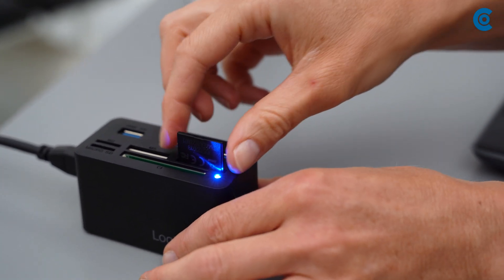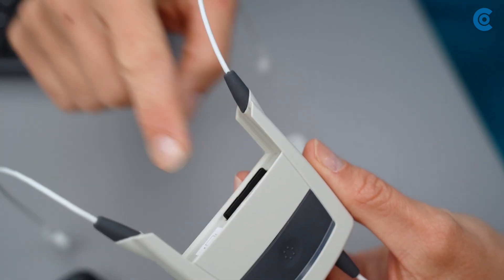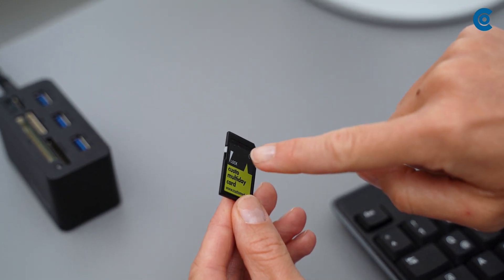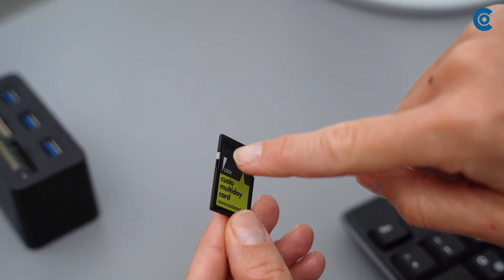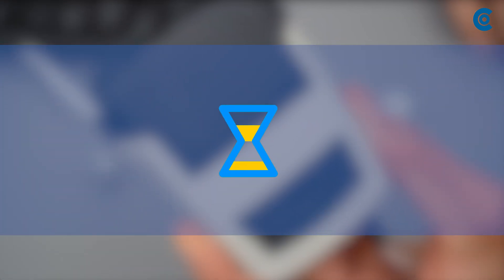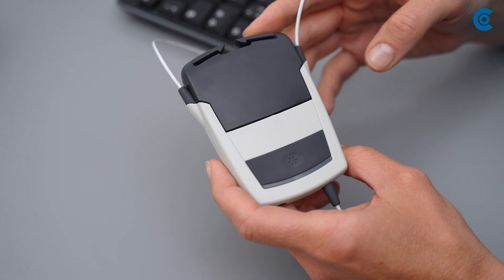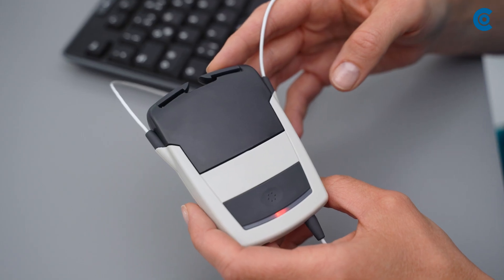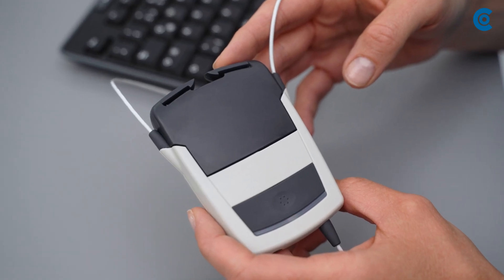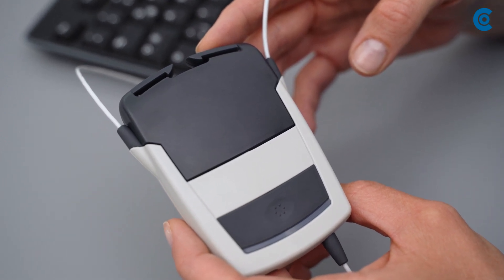Then insert the card into the Custo Flash. Make sure that the right protection latch is in the upper position. Put the battery and the recorder together. It takes about a minute for the recorder to initialize the card and start recording. While the card is being prepared, the LED flashes quickly and green. You can recognize the end of the initialization by the red flashing. The recording starts as soon as the LED lights up slowly and green.